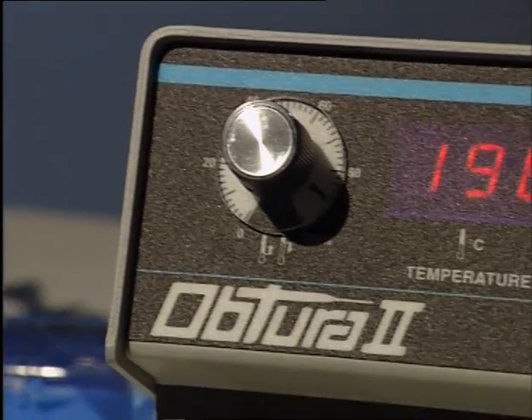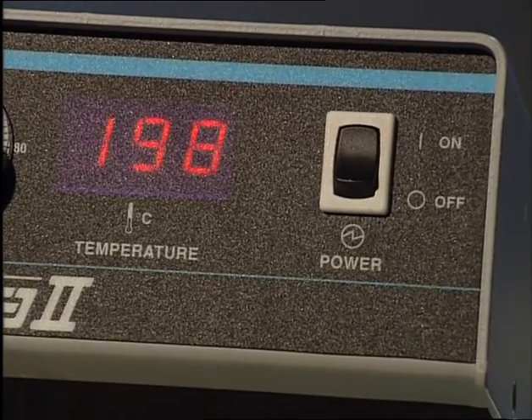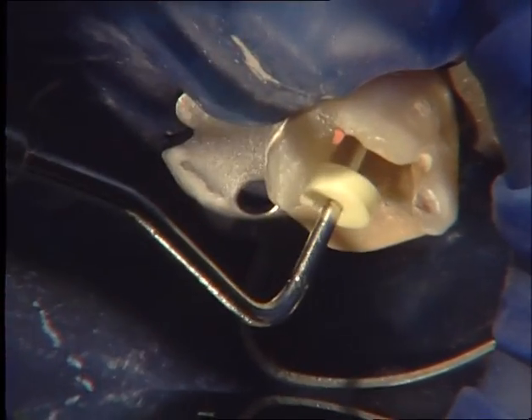Afterwards, the root canal system is filled step by step from apical to coronal with gutta-percha. The best proven system for this technique is the Obtura 2 gutta-percha gun. With this system, you can apply and condense thermoplastic substances in short portions.